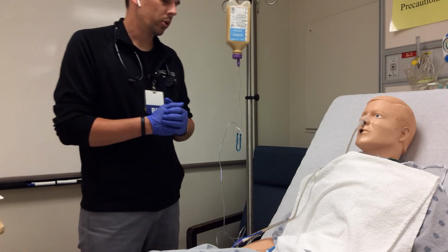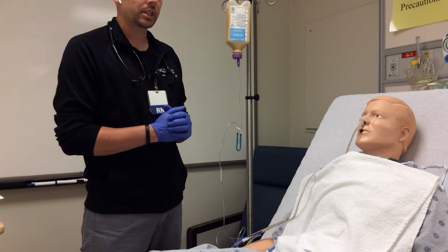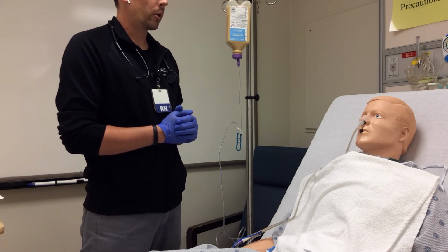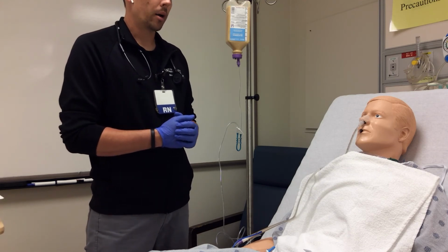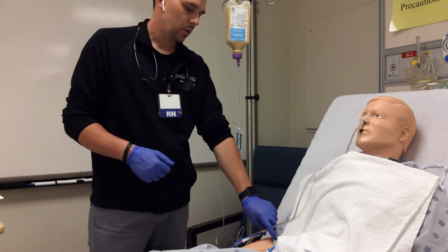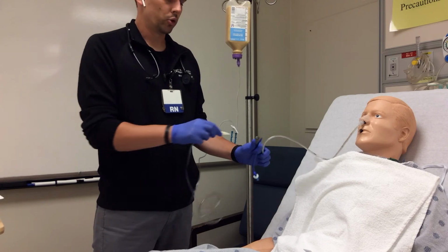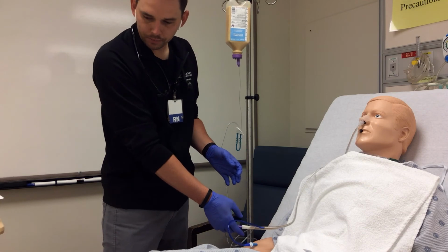What you'll also see ordered most often, every 4 hours when you're doing that assessment, maybe every 6 hours, is that the physician is going to order potentially a free water flush. If there is no free water flush ordered for a specific amount, we are making sure we are going through that process of flushing the NG tube with 30 mLs every 4 hours. So we will pause our tube feed, we will clamp, remove the tubing, and this is why I said that cap is important to hang on to so we don't get this contaminated. We will draw up our water, flush with 30 mLs, and we're doing that every 4 to 6 hours.